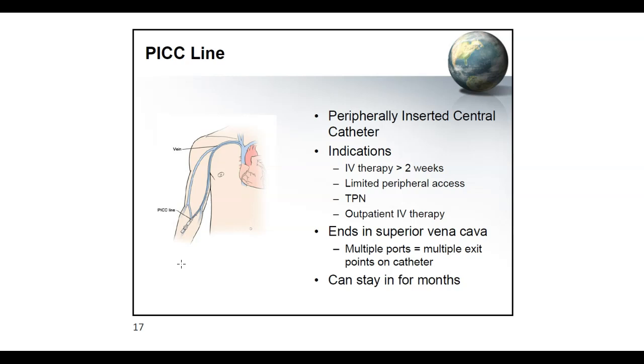But anyway, if you know they're going to insert a PICC line, and you know that your patient has so many medications that may not be compatible, ask them if they can put in a PICC line with multiple ports instead of one with only one port, because that will really save your day, and your patient will be able to get all the medications at the scheduled time.